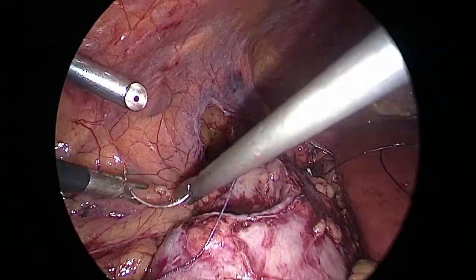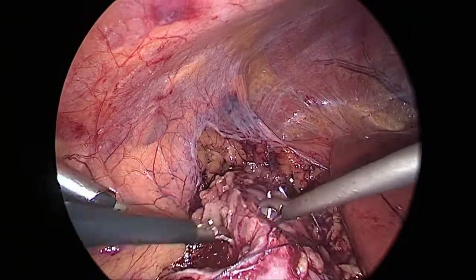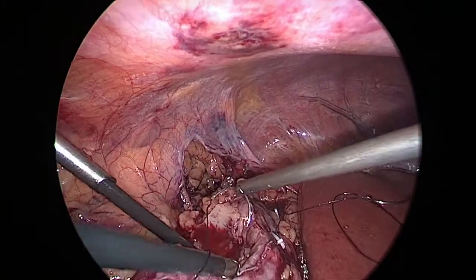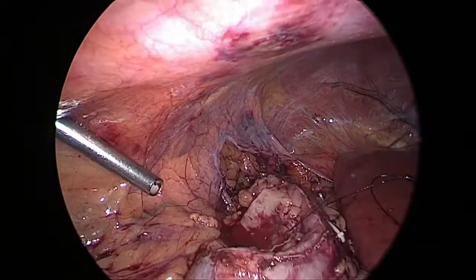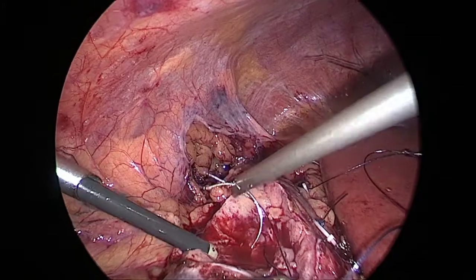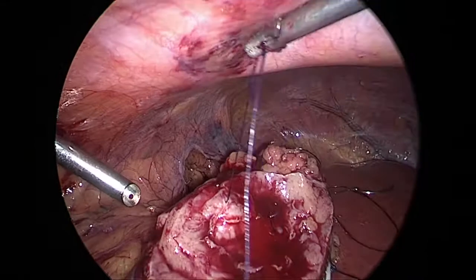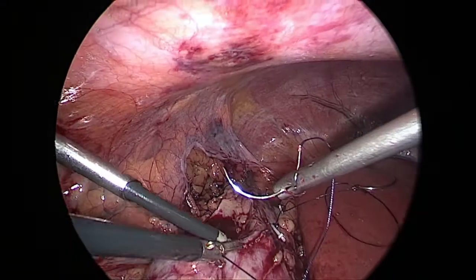Now it is time to do the renorrhaphy. I am suturing the kidney with 2-0 Vicryl. Tumor is not that deep, that's why there is no major vessel or opening up of the pelvicalyceal system.